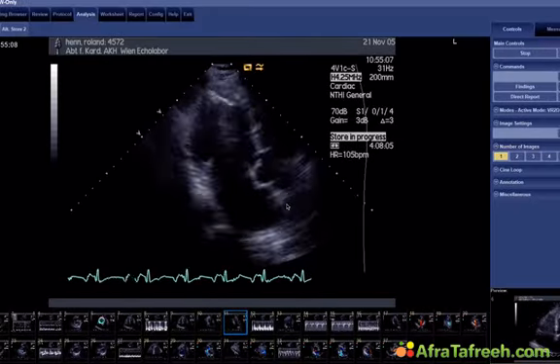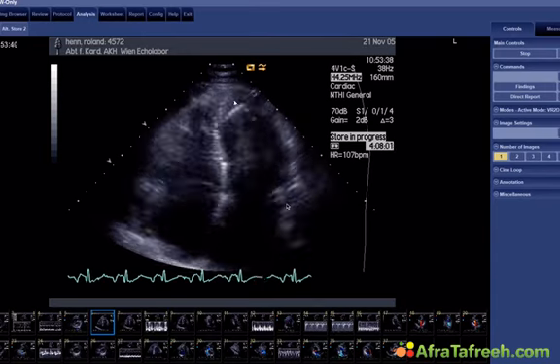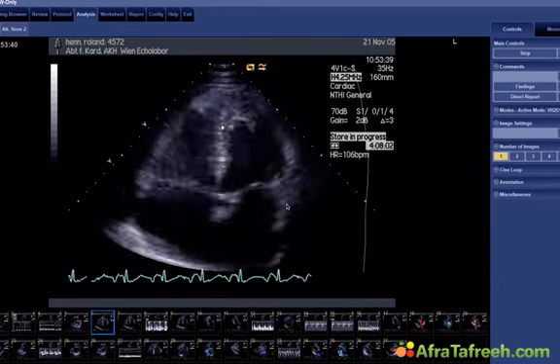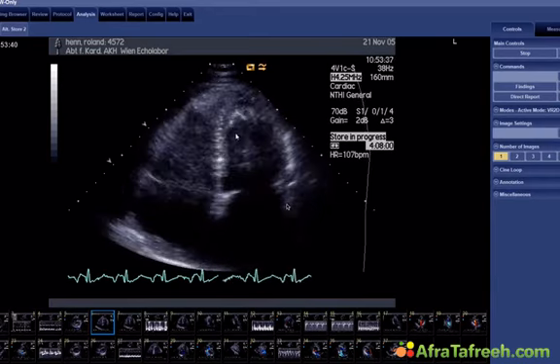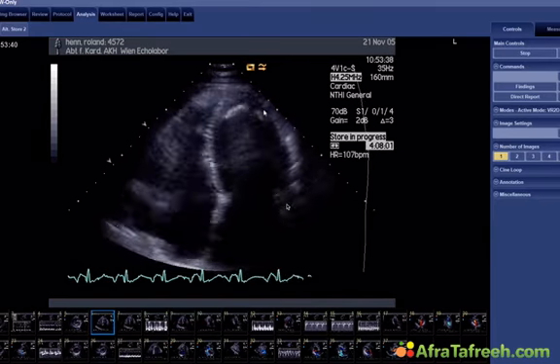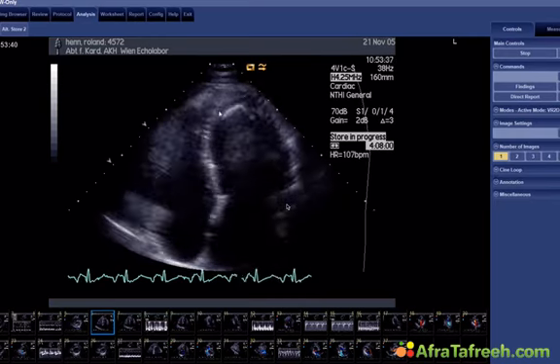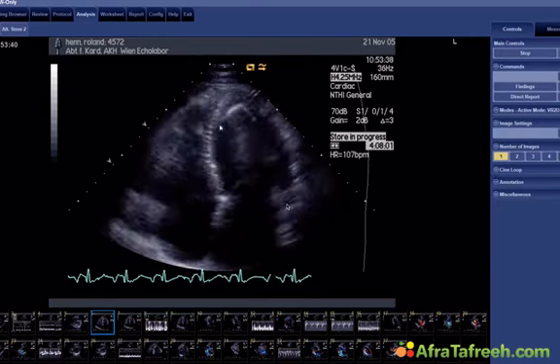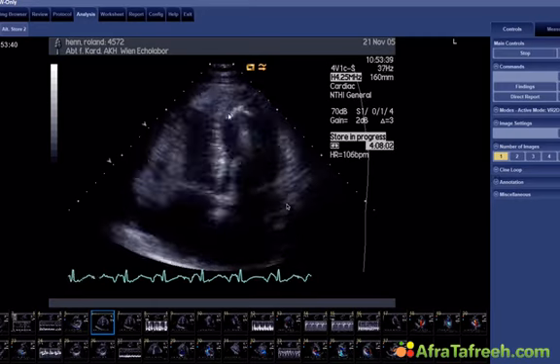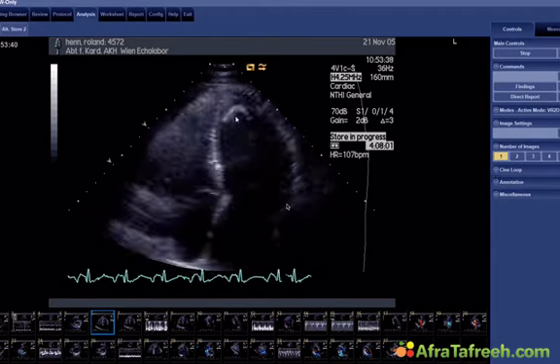This here is the eosinophilic infiltrate, where we have a very echogenic apex. The endocardium is very thick. It might look like a thrombus. People might confuse it with a thrombus, but it's not a thrombus. The big key finding here is that the patient has normal wall motion right here in the apex. You would not find a thrombus in normal wall motion.